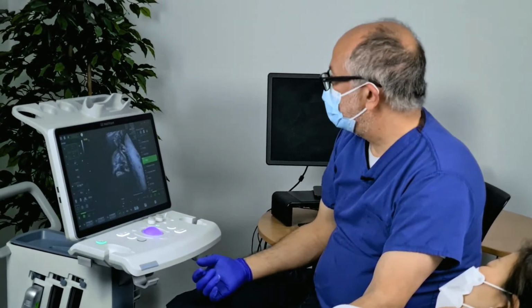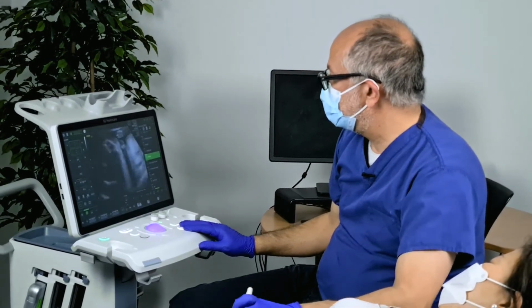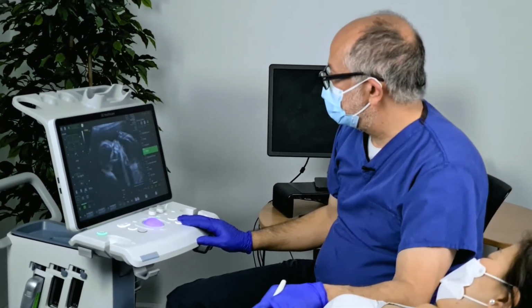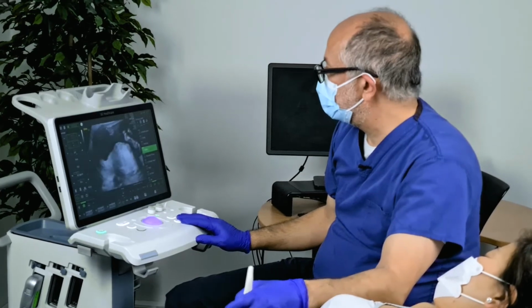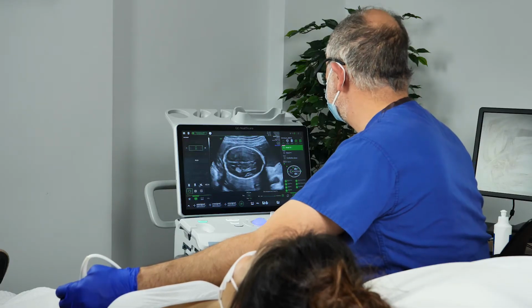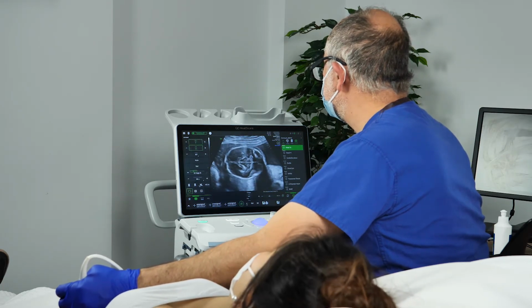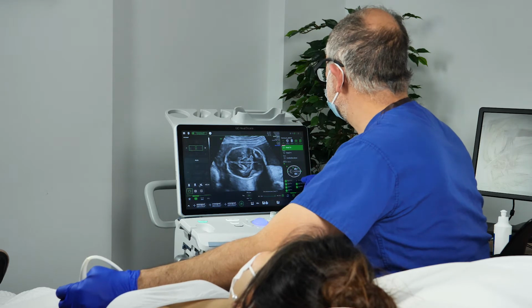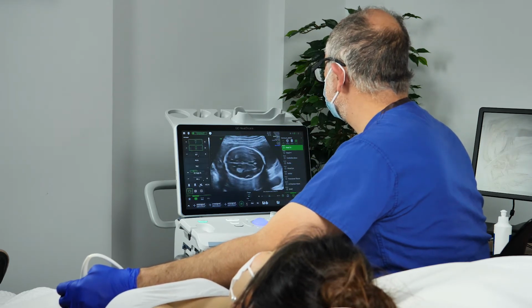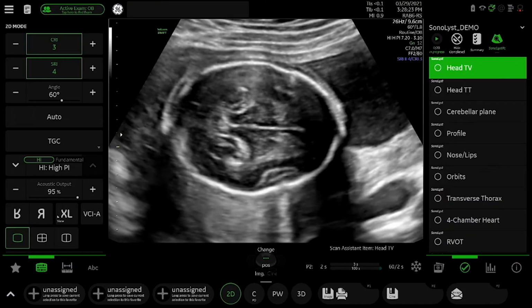And this is why it's got to be pretty flexible to recognize things as you go through and pick up all those different elements. So this is now going beyond that previous system I showed you, where it's just looking at whether a picture is present or not. What this system is now doing is also looking at the quality of the image.